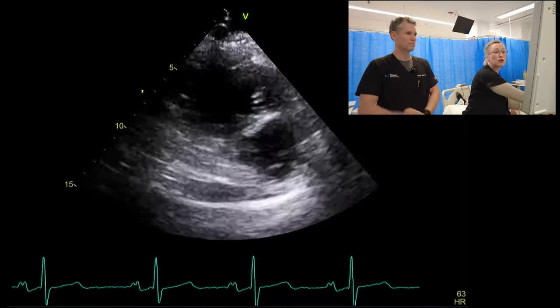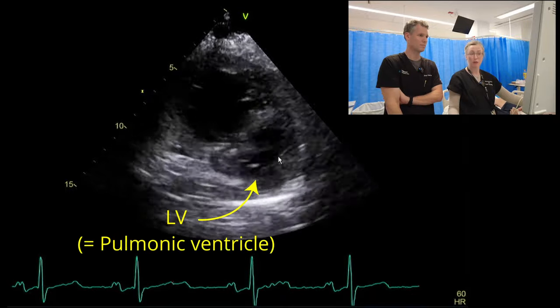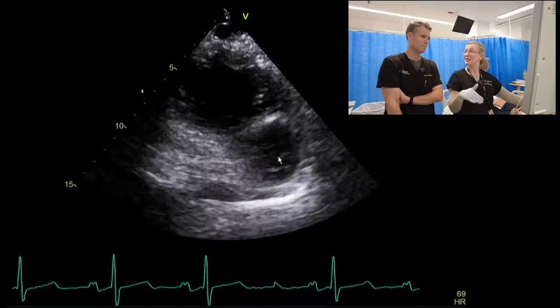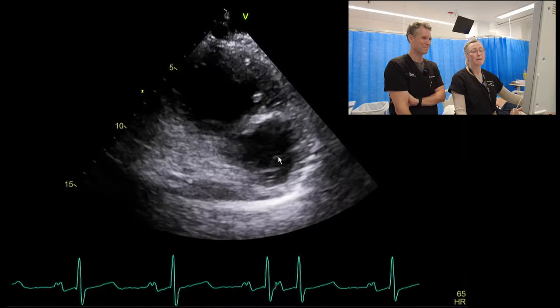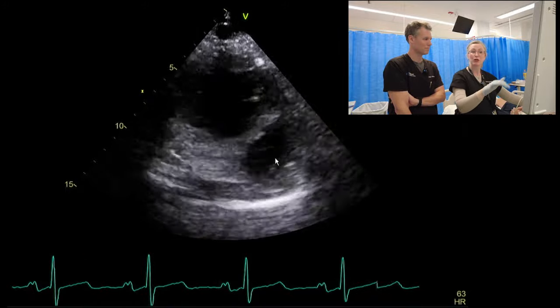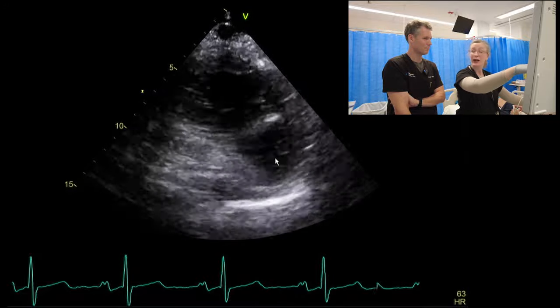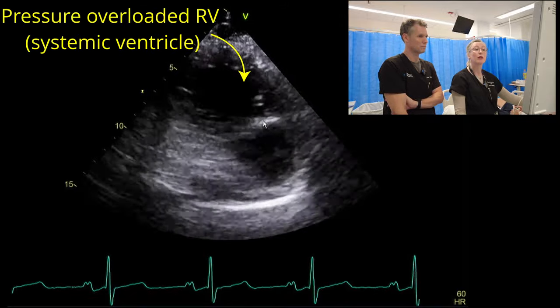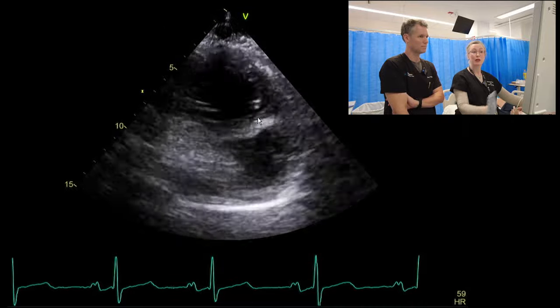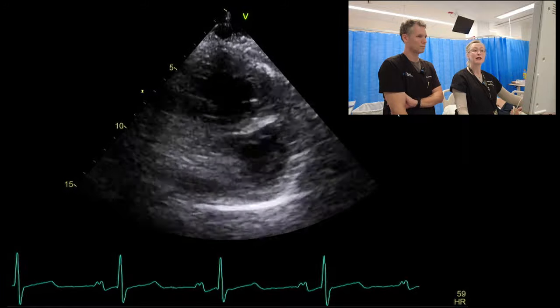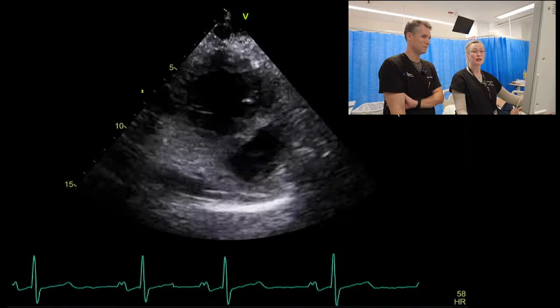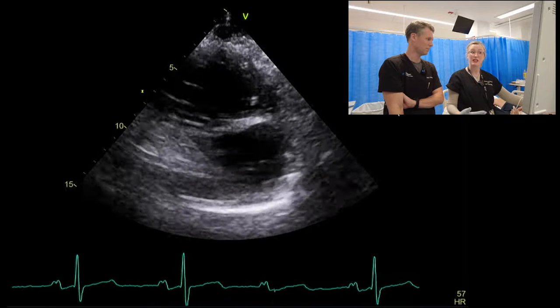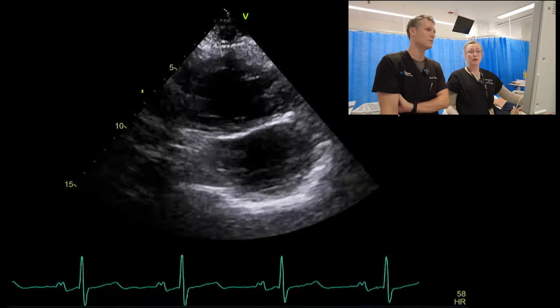Moving to the parasternal short axis, this is our morphological LV, or our pulmonic ventricle. It's generally crescent-shaped, because we've got that systemic ventricle — just like your RV is normally crescent-shaped wrapped around your LV, it's the opposite in this case. You can get nice views to confirm this is definitely the morphological LV that has become the pulmonic LV by looking at the mitral valve and checking it's bileaflet. We can also see the systemic ventricle pushing across the septum in systole and bouncing back in diastole, because it's a pressure-overloaded morphological right ventricle. If that pulmonic ventricle was dilated and bigger than the systemic RV, you'd have to worry about the patient developing pulmonary hypertension and Eisenmenger's physiology.